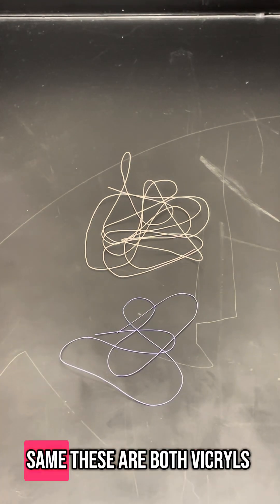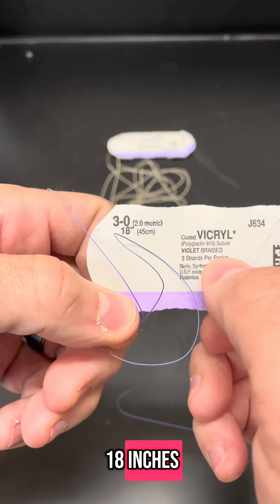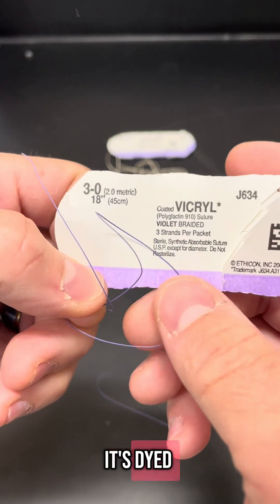What are these two sutures? Are they the same? These are both vikryls. It's a 3-0 vikryl, 18 inches, violet, braided. So it's violet — it's dyed.